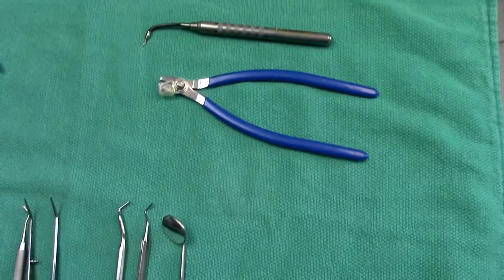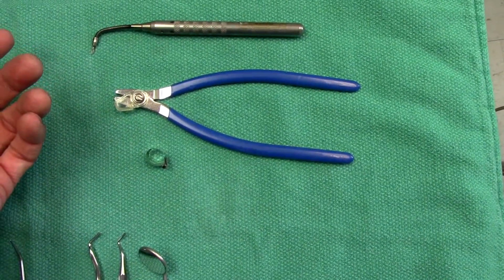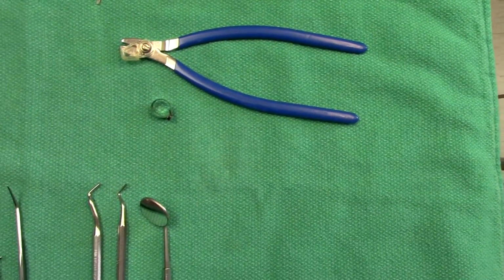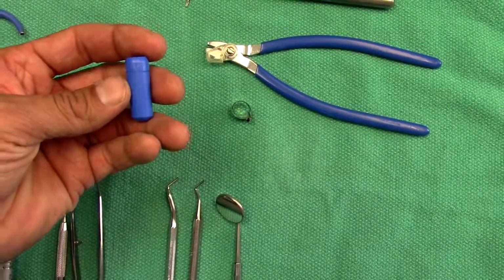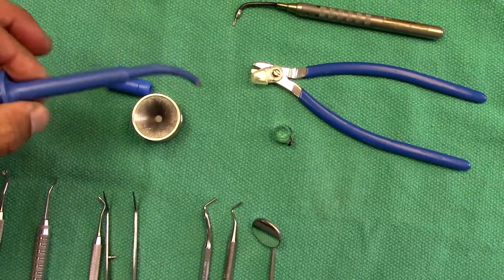So if you're practicing with Automatrix, which I recommend because it's the easiest system to use versus using a Tofflemire for these amalgams, you'll need the wrench and you'll need the cutters, and then obviously you need some amalgam. You'll need like 5 or 6. I think these are single spills, and then an amalgam carrier.